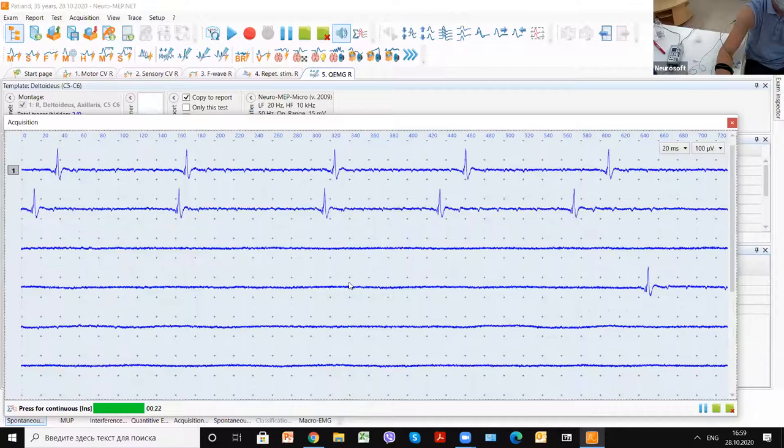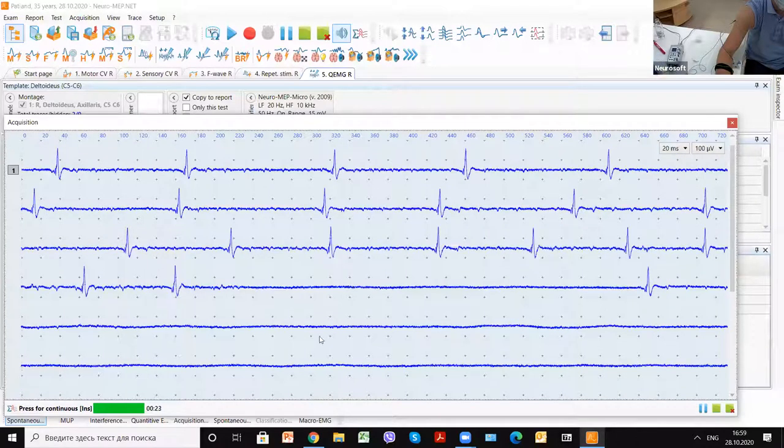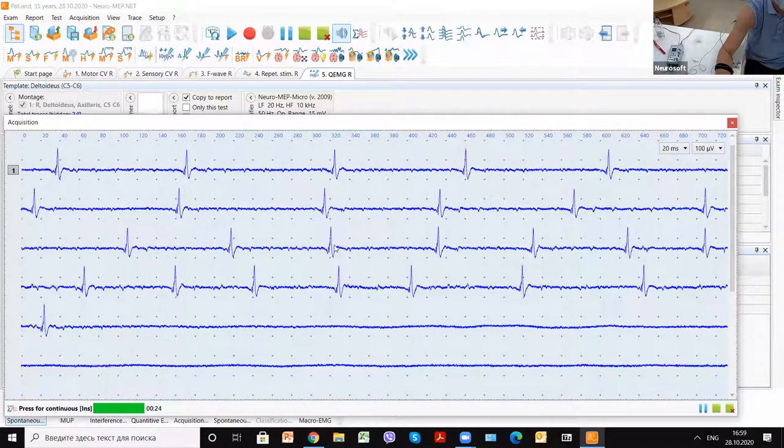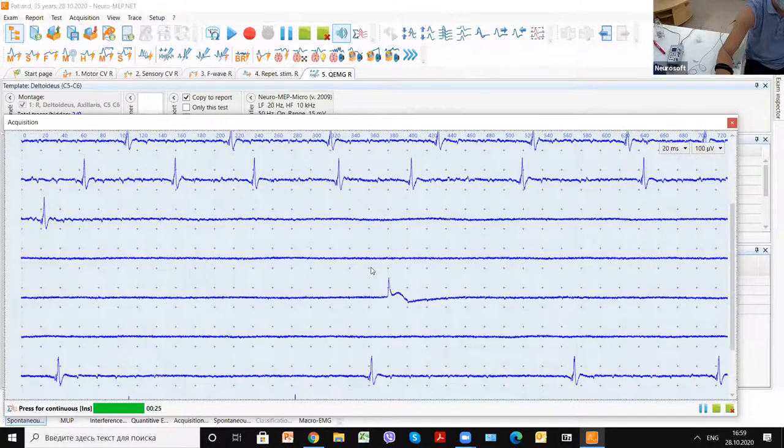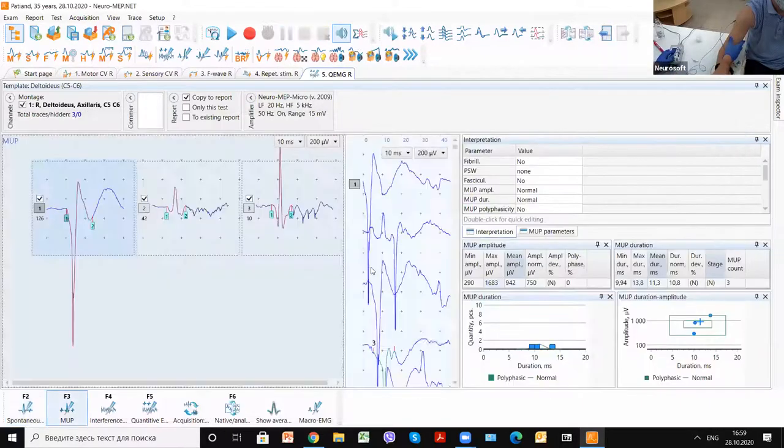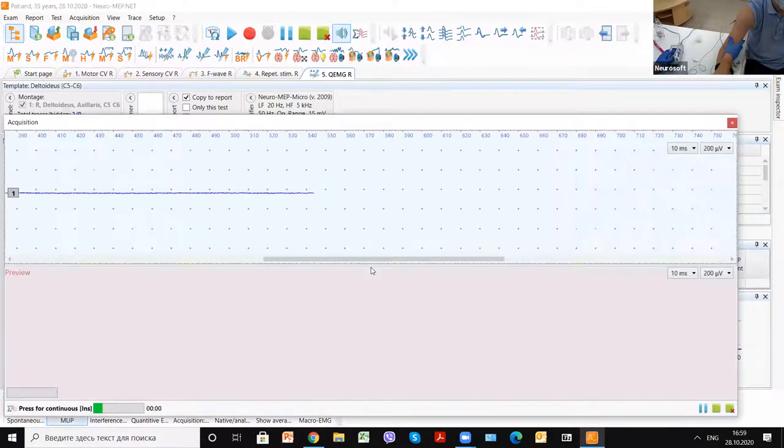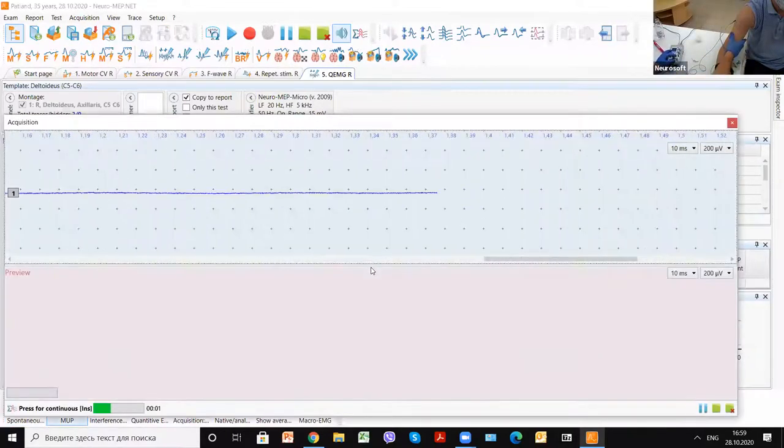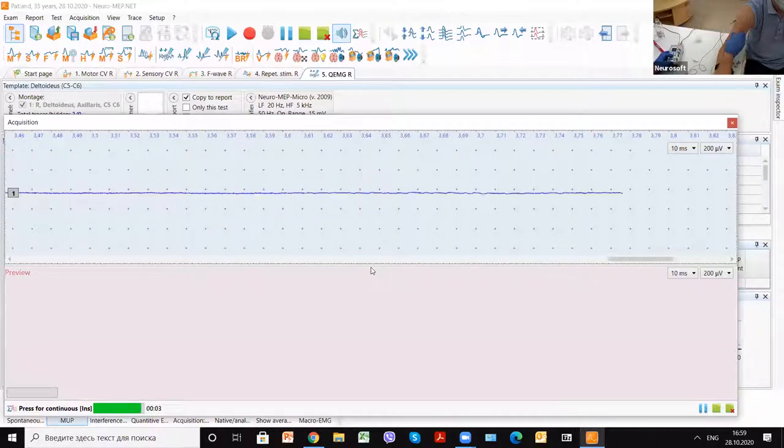We again don't see any spontaneous activity. Fibrillations will look like that. After that, we again can find a little tension.